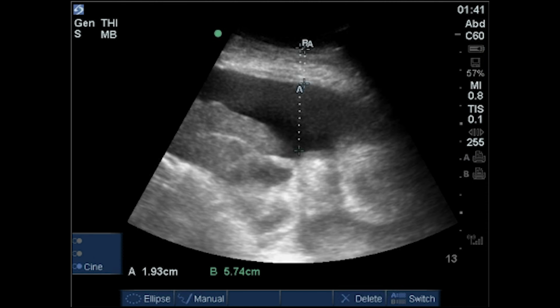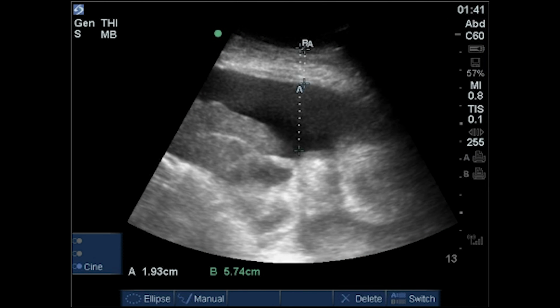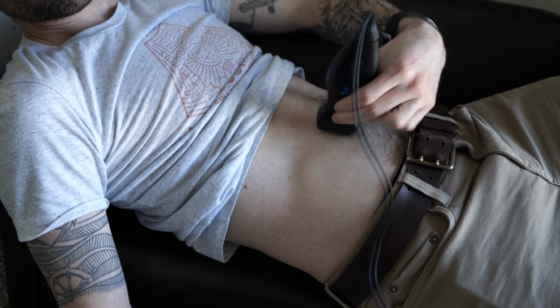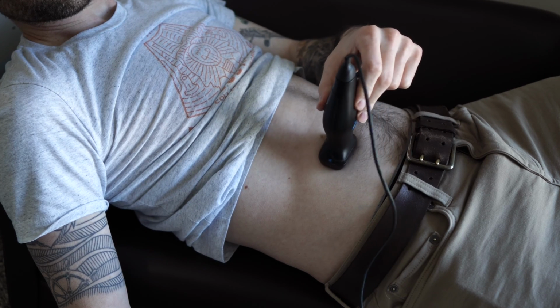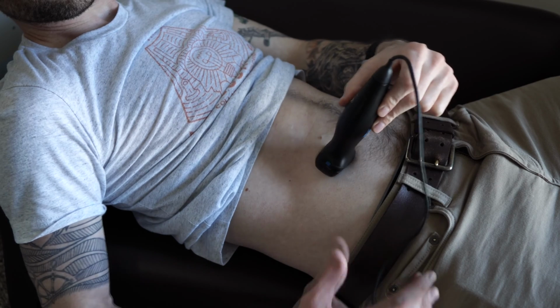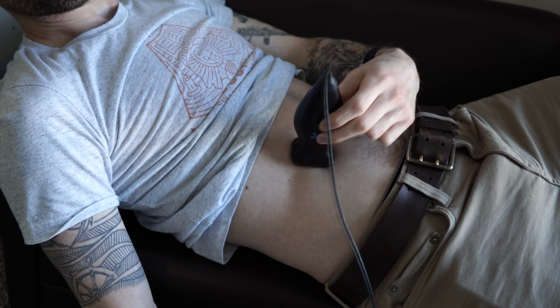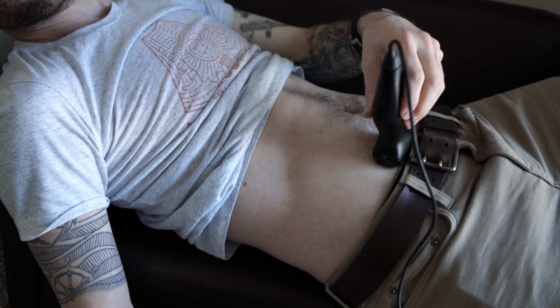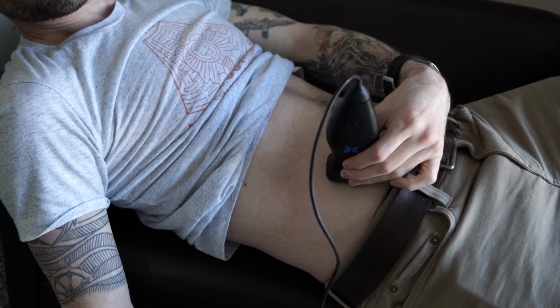In this image, a curvilinear probe is used with the abdominal imaging preset and is placed in either the right or left lower quadrant of the abdomen. The imaging plane can be oriented in either the sagittal or transverse plane of the patient's body, or even somewhere between these standard planes, although by convention, the probe marker should generally be oriented in the cranial direction or towards the patient's right side. The operator would then slide the probe around the outside of the patient's abdomen and attempt to find the deepest pocket of fluid.